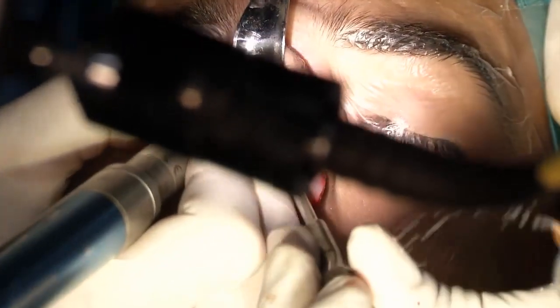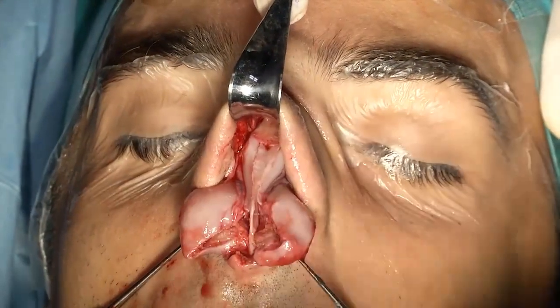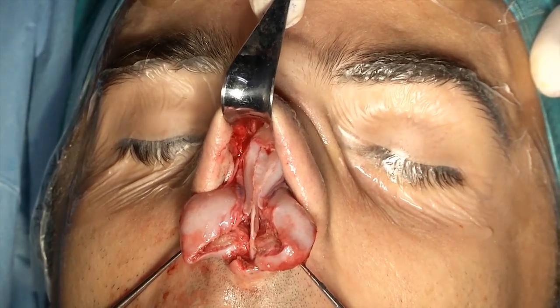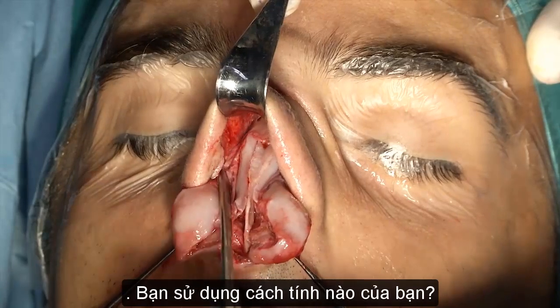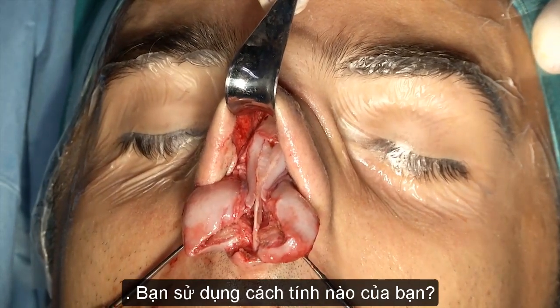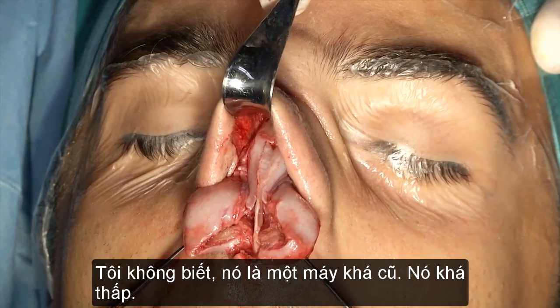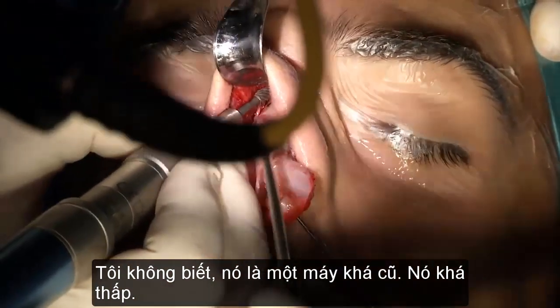Dr. Robotti, hello. Yeah. Just a simple one. What setting do you use on your coagulation? I don't know. The coagulation is probably, it's an old machine. It's a blend for the cautery, and the coag must be, how much is the coag? It's very low. Yeah, it's very low. I would imagine that. Thanks. Yeah, 2.7, she said.